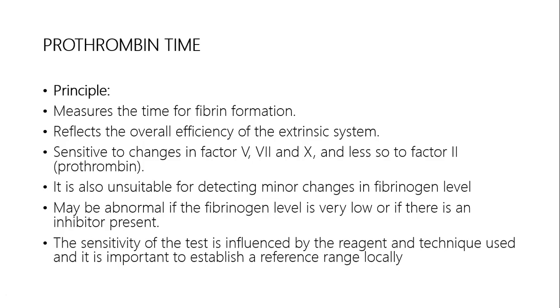Or, another scenario, kung okay man ang concentrations ng clotting factors 5, 7, 10, and 2, but may ara nga ga-exist nga inhibitor sang imo nga clotting factors 5, 7, 10, and 2, mangin abnormal man ang prothrombin time sang imo nga pasyente.